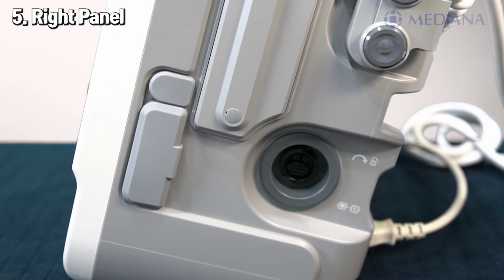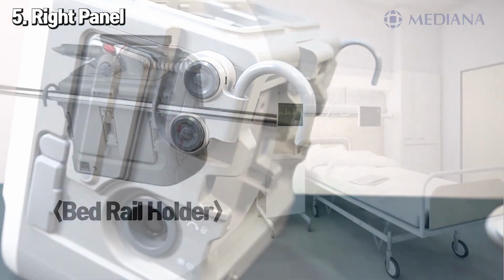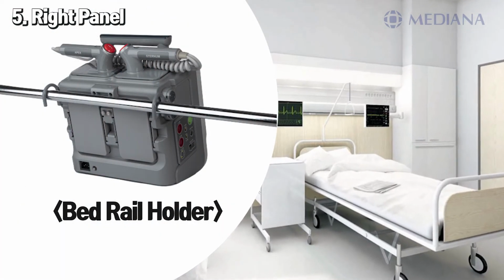Also, this pads connector part is designed to be slightly inserted in the equipment, so it can be protected from external shock. Crucial for the patient's bed, the bed holder enables this device to be fixed on the patient's bed, enhancing convenience and usability for medical teams.